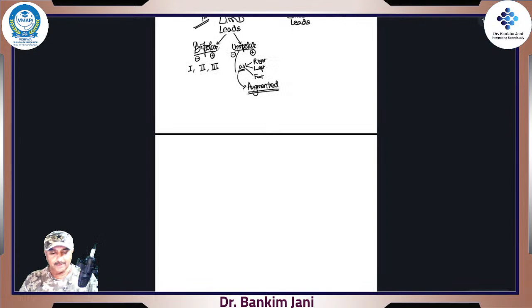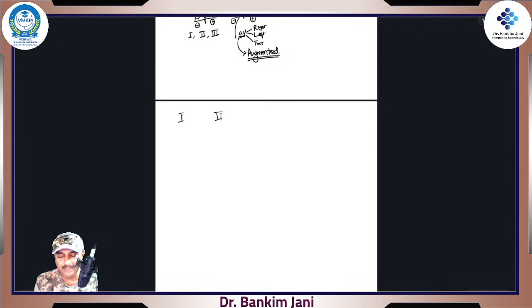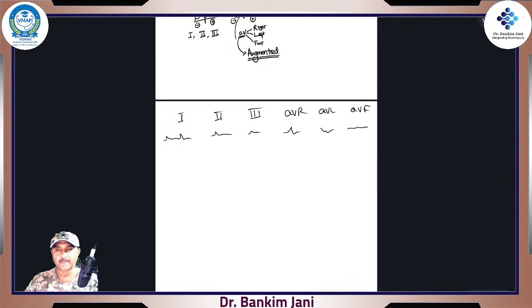Just for example, on one ECG paper there is 1, 2, 3, AVR, AVL, AVF, and you'll see the deflections here, here, everywhere it is like that. But if we don't increase the current, it would be so small. It is like we say, okay, draw a graph.